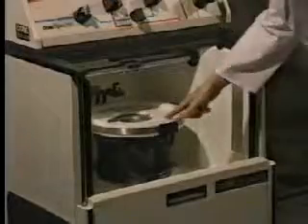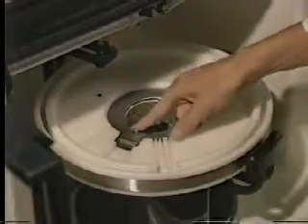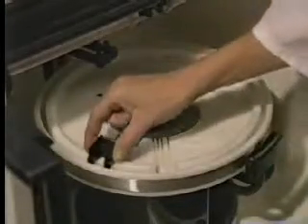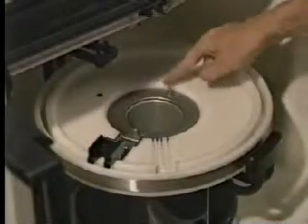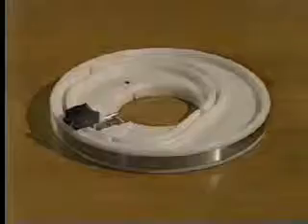If a different filler is in place, remove it as follows. Push the filler latching pin toward the center of the centrifuge and raise the filler latch. Push the filler locking pin toward the center of the centrifuge, hold, and raise the filler with both hands.